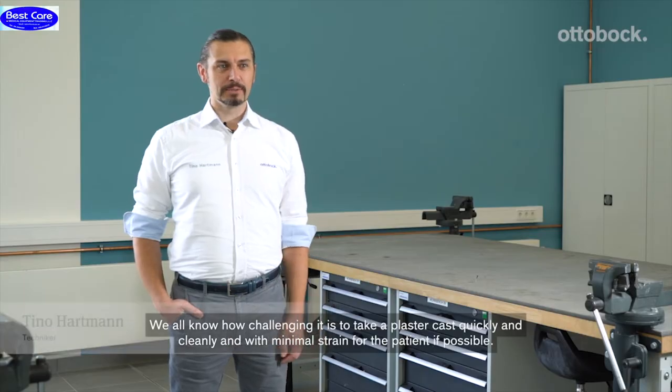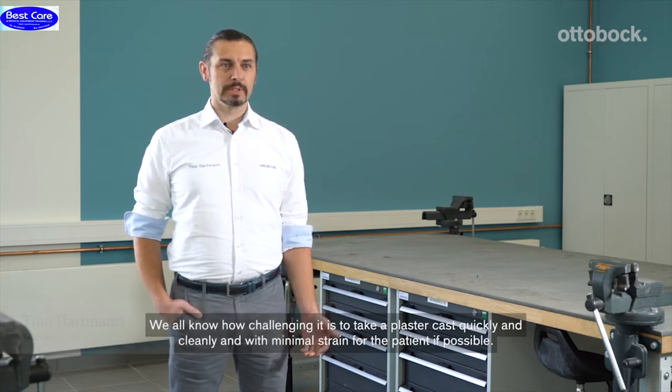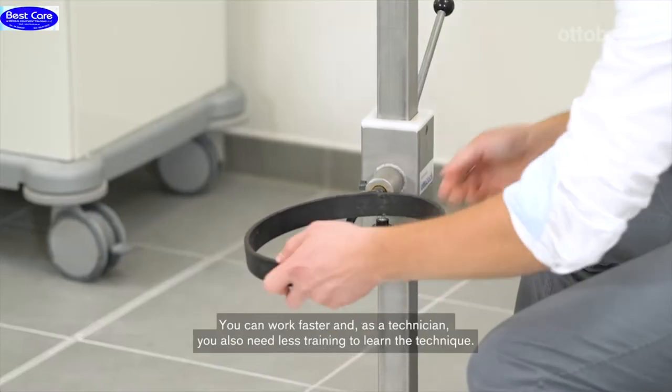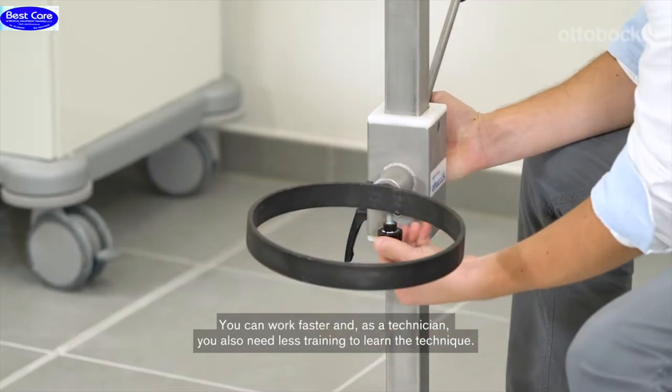Everyone knows the challenge. It's easy and easy to use for the patient. With the Y-Cast device, all this is possible. You can work faster, and for the technician, this means a small amount of effort in the technique.